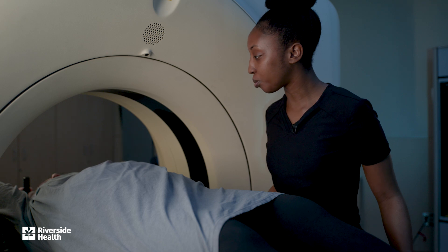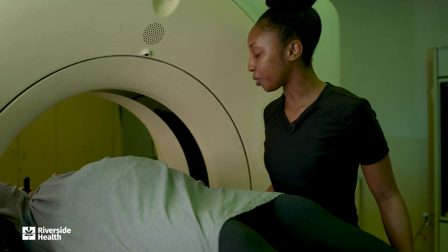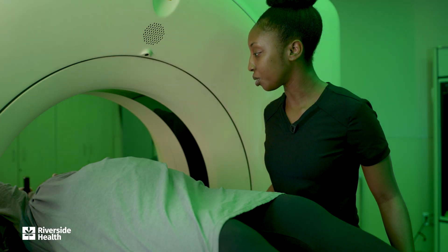Inhale one more time. Perfect — and hold. Perfect. As your radiation therapist, we are here to help support, encourage, and guide you throughout your whole radiation treatment.